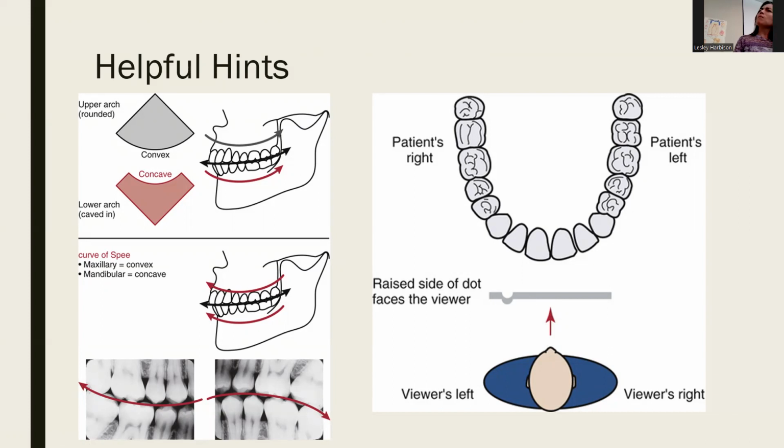I don't know if all films have that, but maybe they do. We'll look for that tomorrow and see, because I don't remember that. That might be something I never paid attention to. We'll have to look at them tomorrow, because that would be another good thing to make note of. It's on the actual film. It just says A. In the mouth.